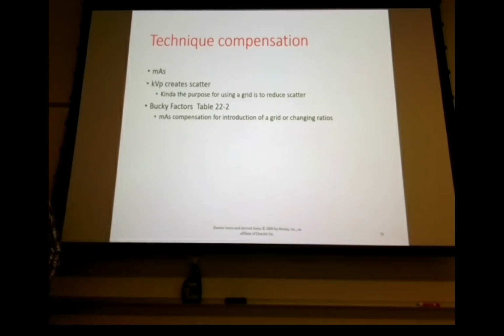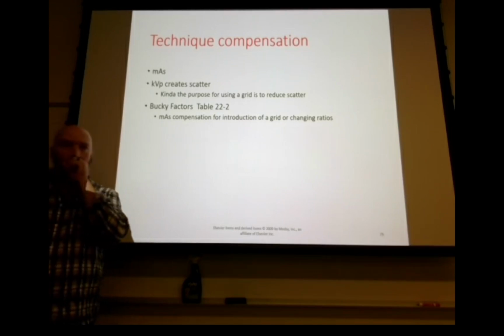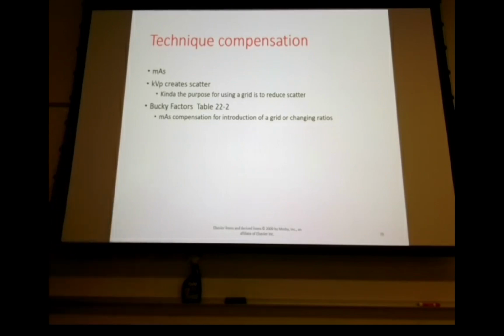So let's say you're doing portables. You're doing portables on a patient, they're getting ready to try to feed this patient, they put a feeding tube into the patient. What do they usually ask for whenever they drop a feeding tube, as far as x-ray goes? They just want the end placement. They just want to know where the placement is. What specifically do they want to see? Stomach. They want to see that it's in the stomach and not in the right main stem bronchus, right?